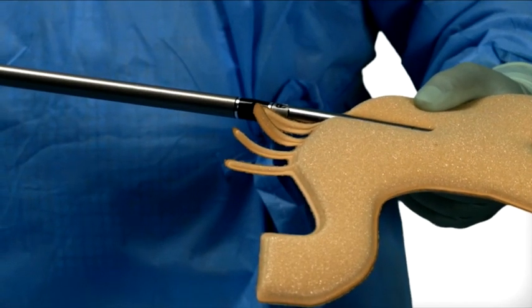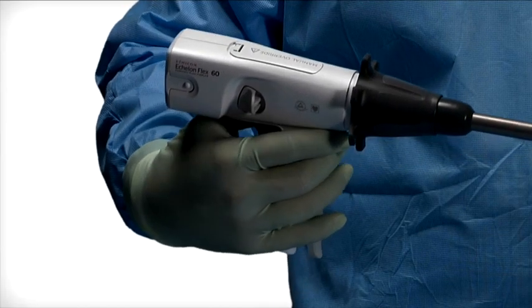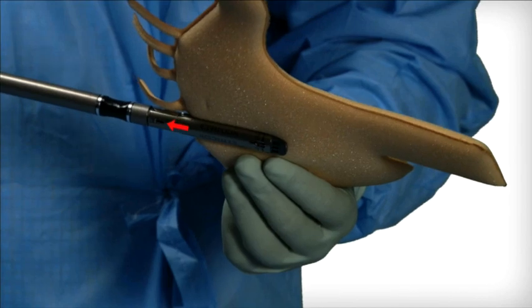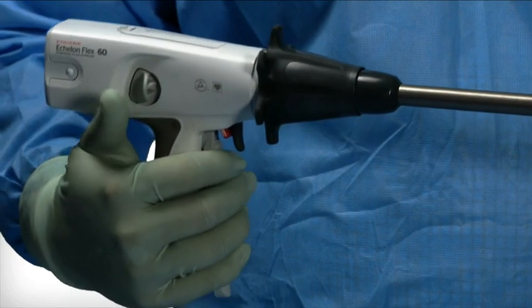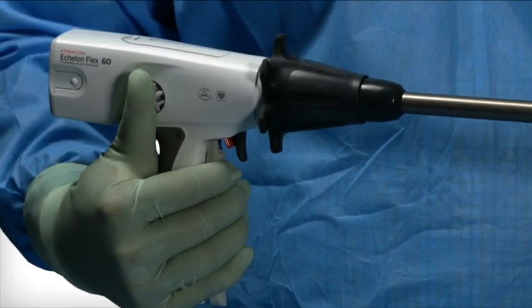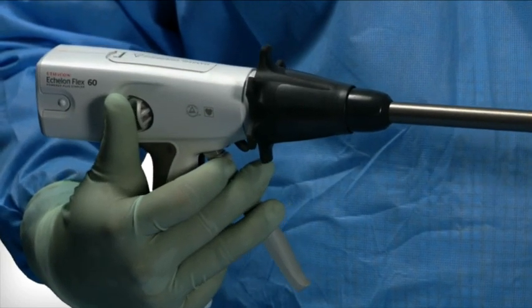When the motor stops, release the firing trigger to automatically return the knife to the home position, opening the jaws. Ensure the knife is in the home position by doing a visual check of the underside of the reload jaw. Squeeze the closing trigger while simultaneously pushing the anvil release button on the side of the device, then maintain pressure on the anvil release button and slowly release the closing trigger.